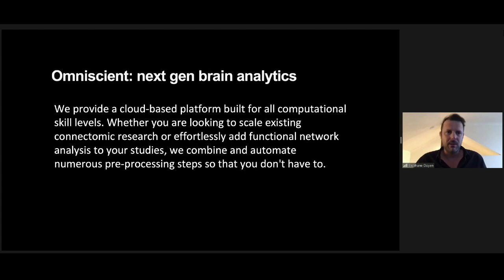So, in a nutshell, Omniscient is a cloud-based platform which is built for users from all computational skill sets and levels. This is a platform that is there to help you to work with some of the latest analytics you can find on the market for processing brain scans, whether this is for your research or with others. We have built this in a way that you don't need to do any coding and you can access all those goodies.